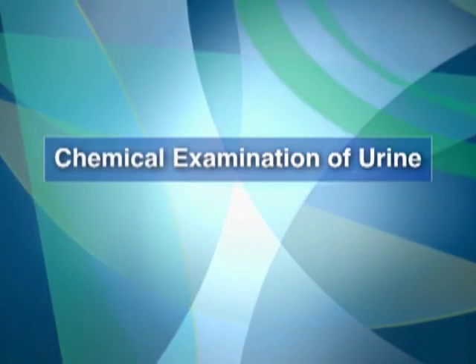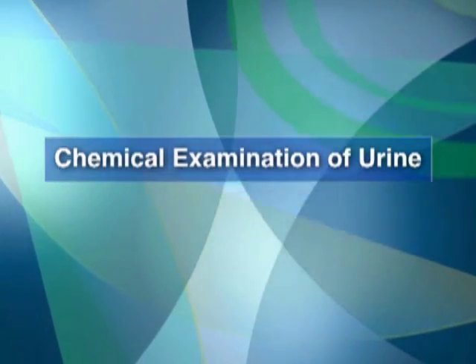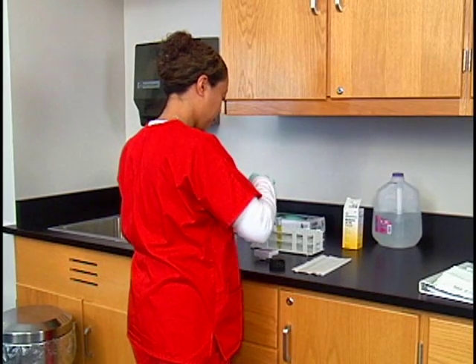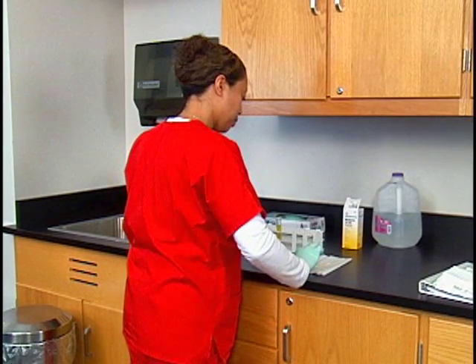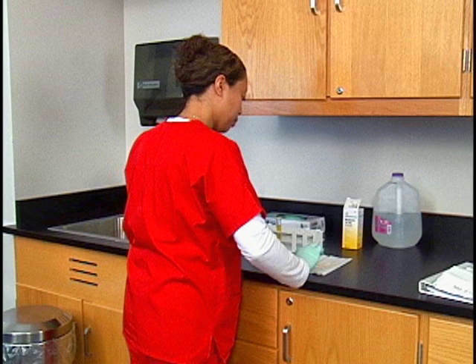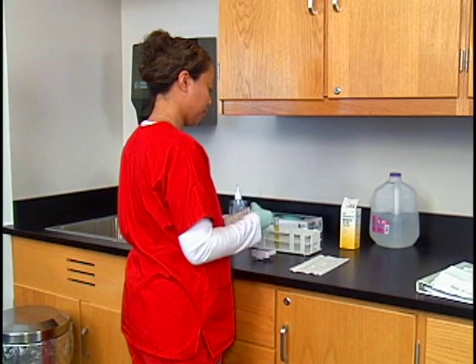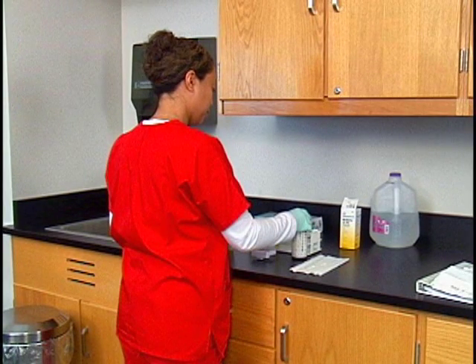Next, the chemical examination of the urine specimen is performed. Remove a reagent strip from the plastic container. Do not touch the reagent areas with your fingers or lay the reagent strip on the table. If you need to put the strip down, you can lay it on a clean, dry paper towel. Recap the container immediately to prevent exposing the strips to moisture, light, and heat.